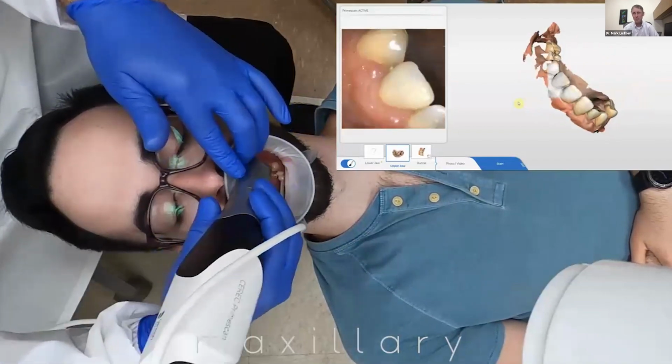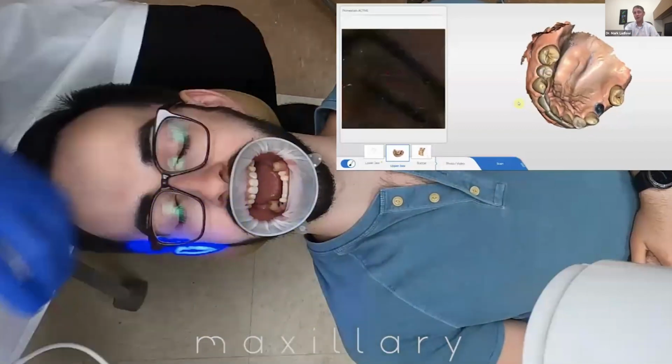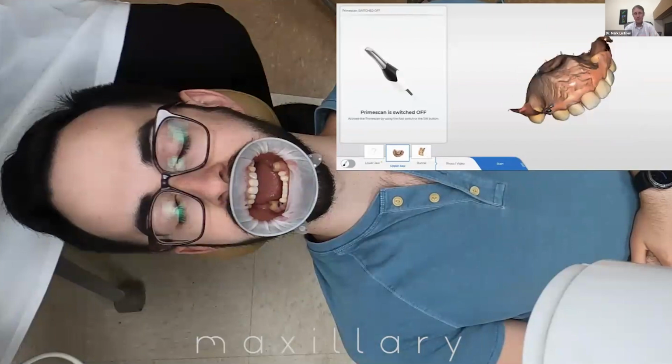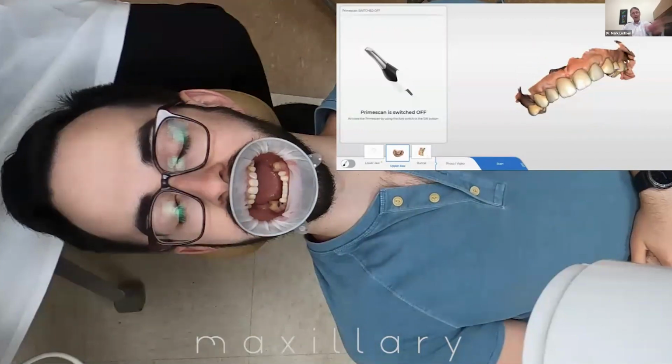That's the general scan pattern that we use for this particular scanner, and to be truly honest, for most of our patients, because it is the scan pattern which works the best for most of the scanners, at least that we've seen. So that's how you do it. Again, 12 o'clock position, scanner right in front of you. And you'd be amazed at how just positioning yourself and the scanner relative to the patient in the right spot makes a big difference to scanning quickly and scanning accuracy.